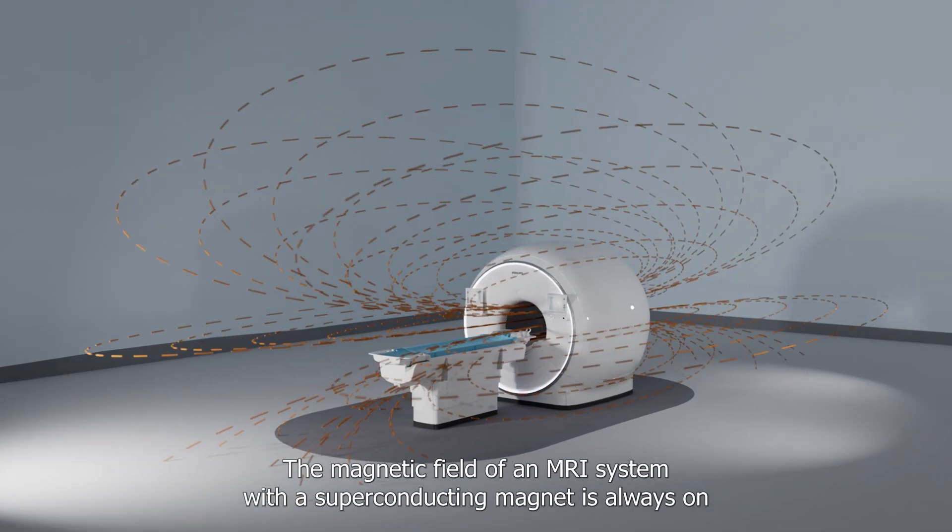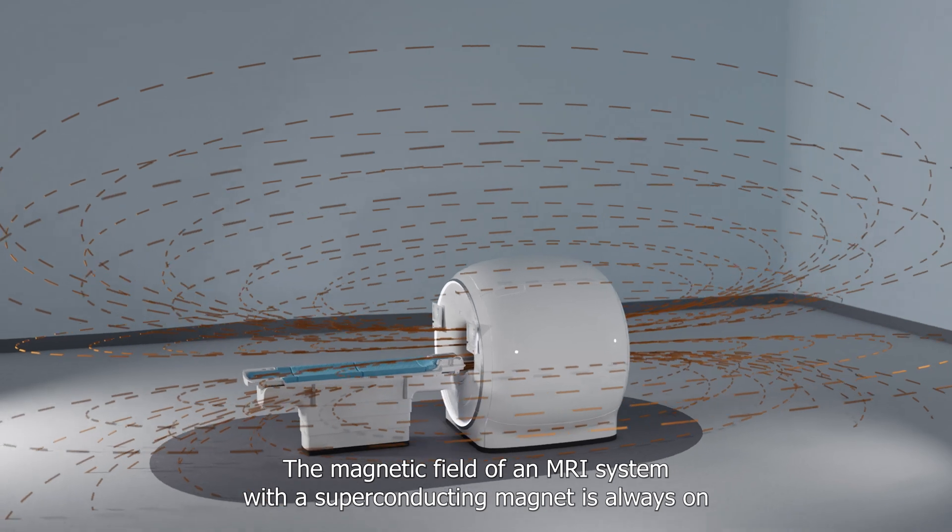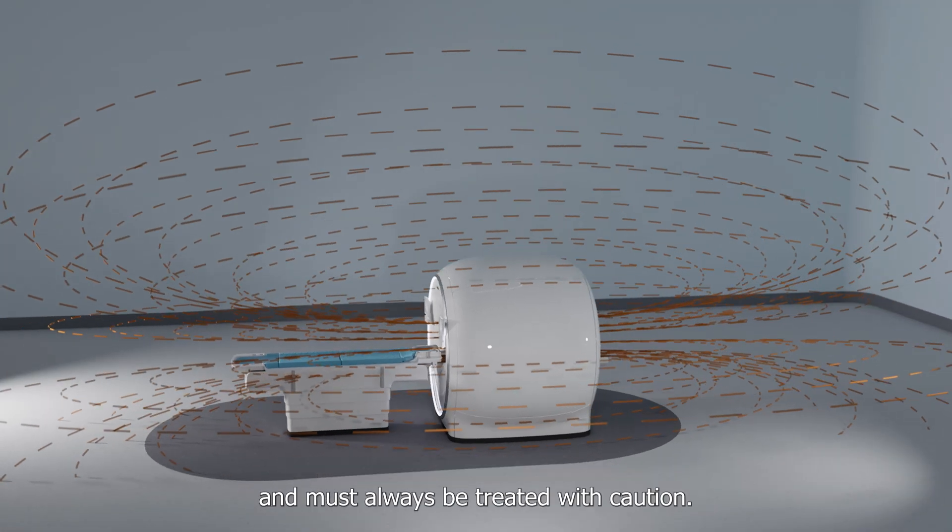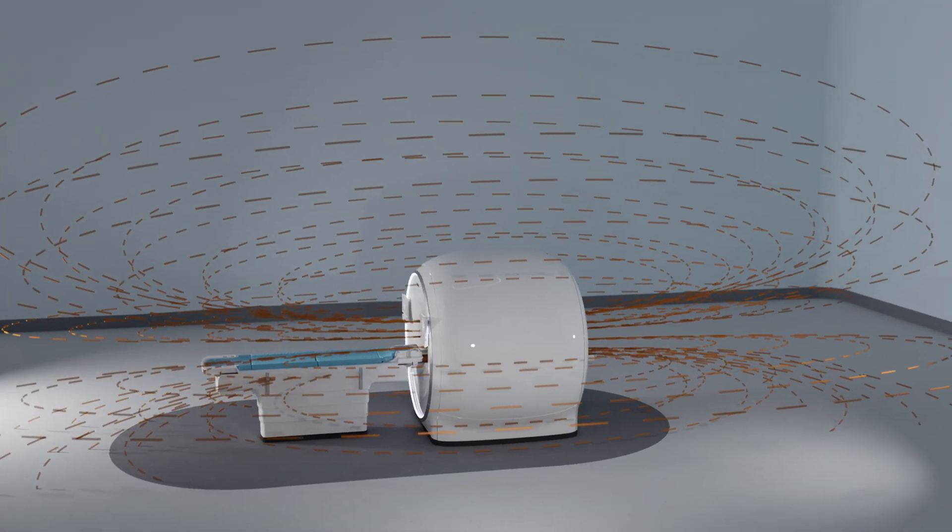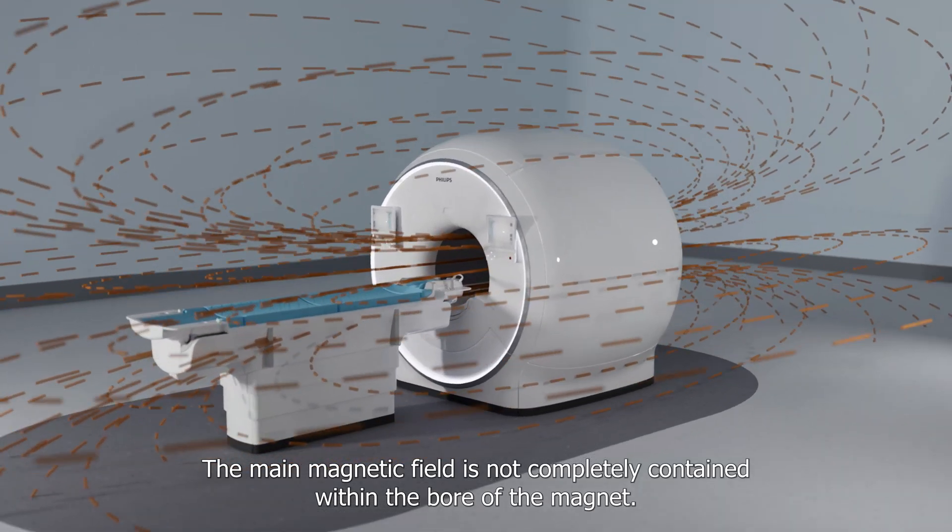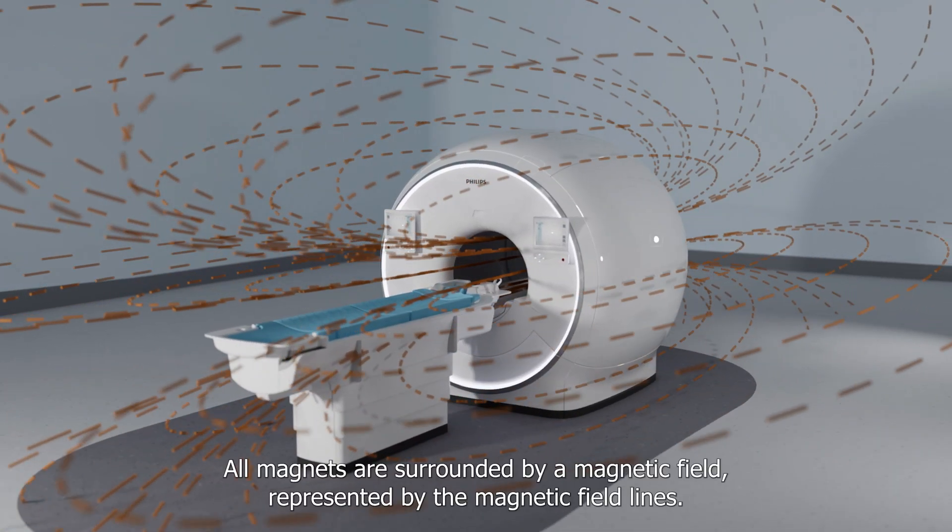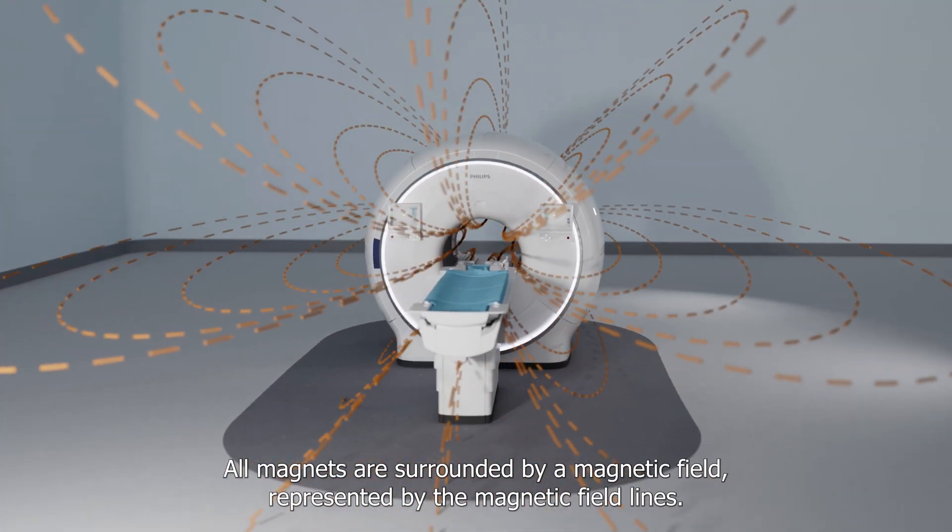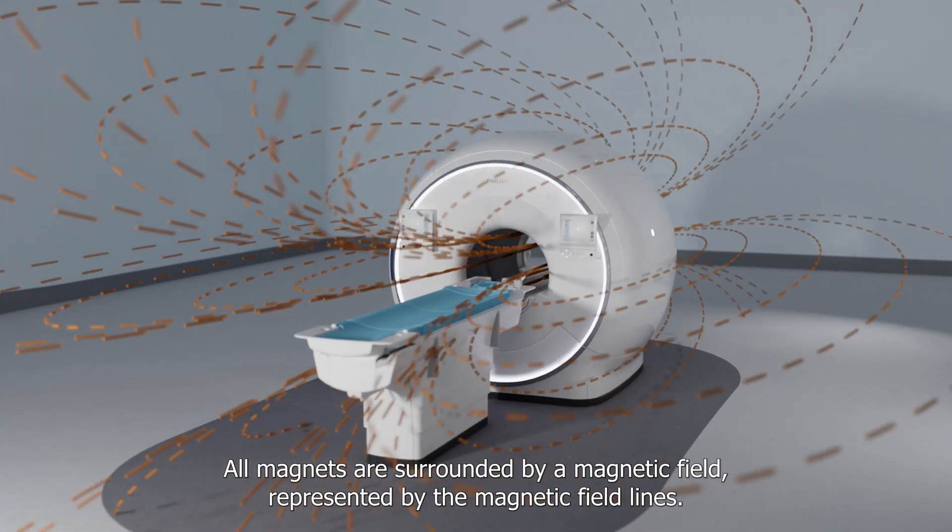The magnetic field of an MRI system with a superconducting magnet is always on and must always be treated with caution. The main magnetic field is not completely contained within the bore of the magnet. All magnets are surrounded by a magnetic field, represented by the magnetic field lines.